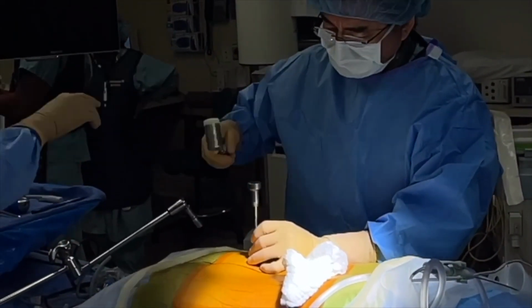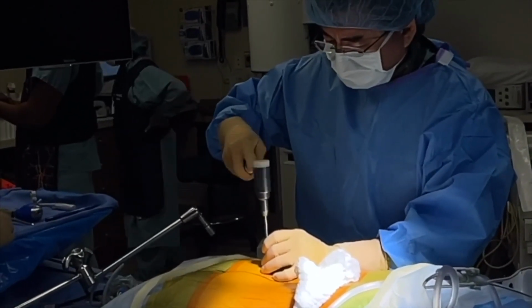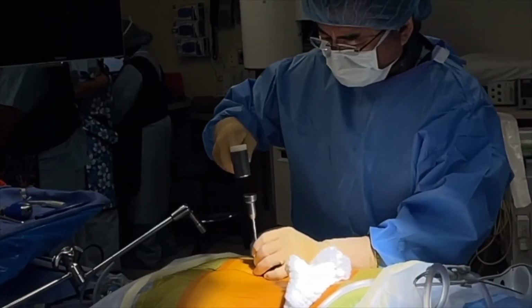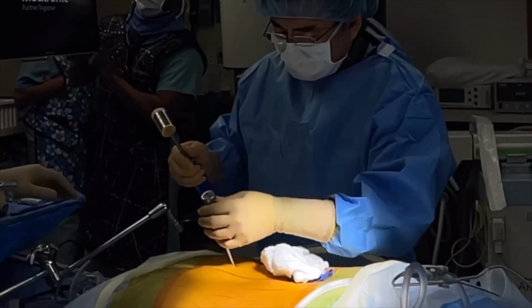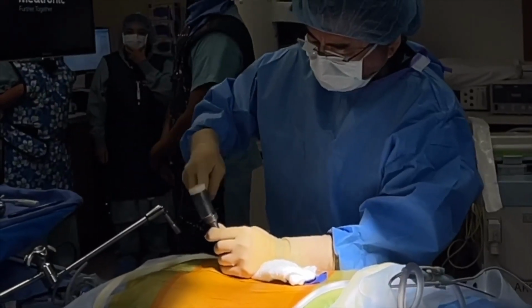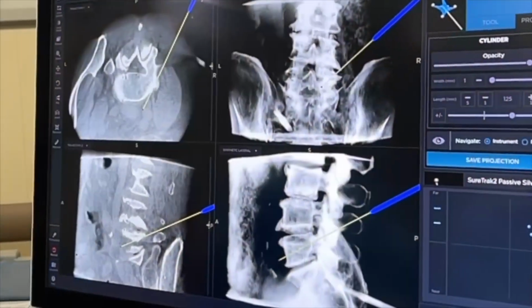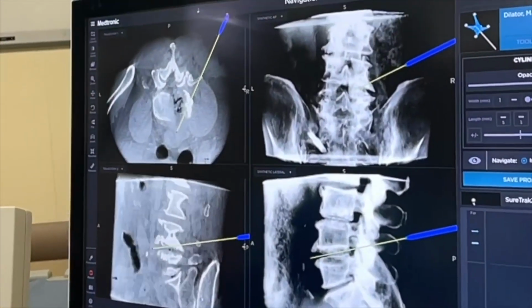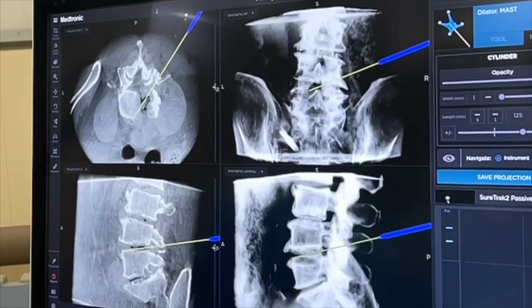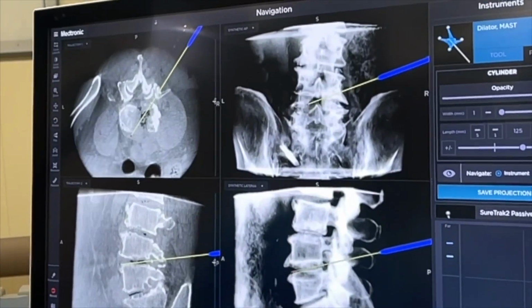Mallet. Look away. Stabbing you in the butt. Oh, good, healthy bone. That's the little antenna that you put on the top of your golf cart for navigation. Perfect. Getting started. This is the part where I feel like I'm a cheater because look at this. You don't even have to be a spine surgeon to do spine surgery if you got 3D navigation. But don't tell my patients that.